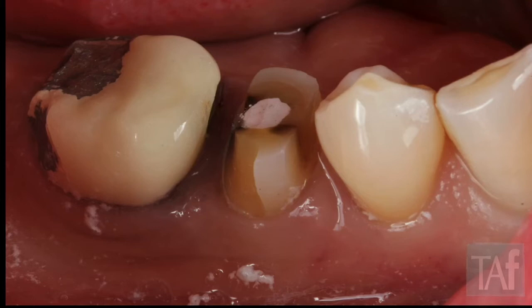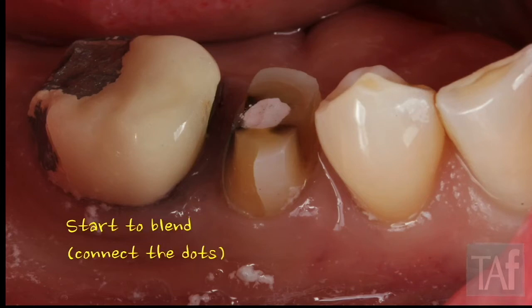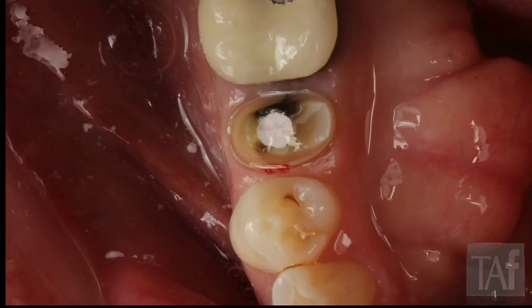Then all you start to do is blend everything together. You have a system now — you can connect dots. It becomes much easier to finish your occlusal and buccal reduction when you've implemented these steps. Here's the occlusal view where I'm already three-quarters through it — already three-quarters done. I'll tell the patient after however many minutes — could be five, could be ten, depending on how many breaks they need, whether they're gagging or choking. You do the best you can, work as quickly and efficiently as possible, and then tell the patient where you are in the process because they want to be involved.